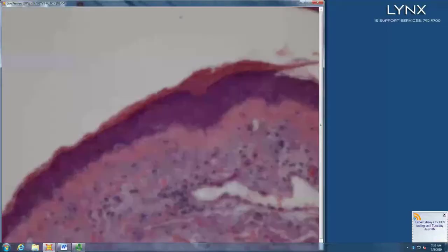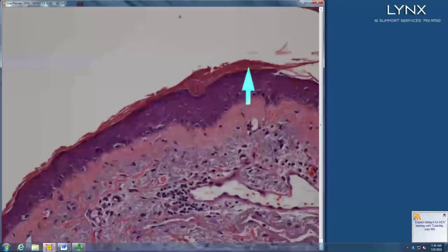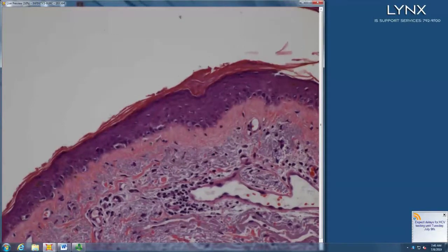Superficial fibrosis. So you have a little bit of compact hyperkeratosis. You have some pigment incontinence suggesting there's been damage to the basal layer. And in fact, where is your basal layer? Or is it gone? So interface change.